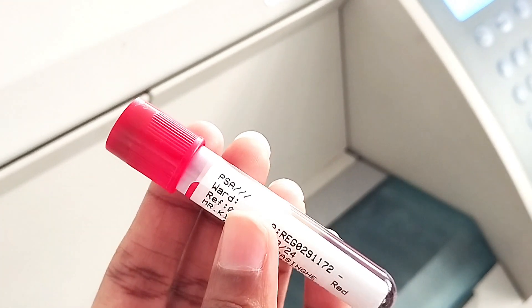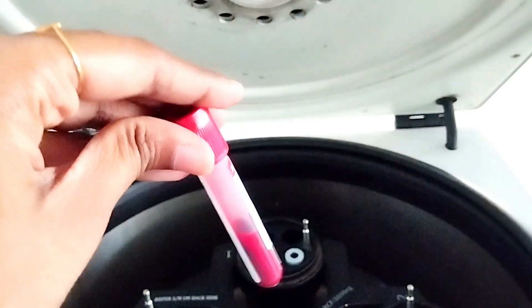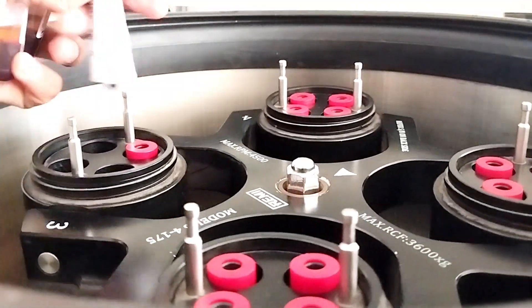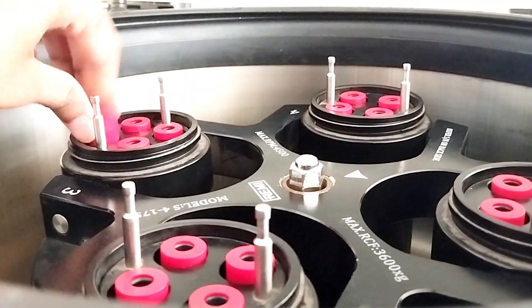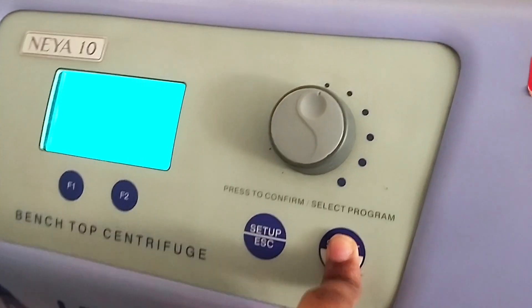If the sample has been collected into a plain tube — that is, a tube without anticoagulants — you have to wait until the blood clots before centrifugation. The blood samples are then placed in a centrifuge and centrifuged at a specific speed, generally between 1500 to 2000 RPM, for about 10 to 15 minutes.